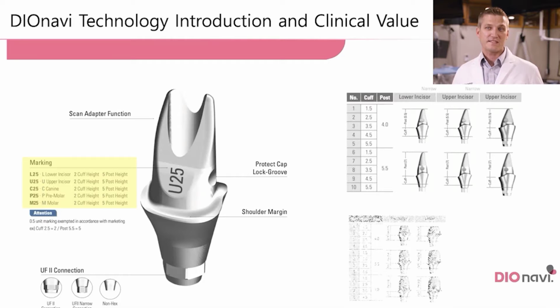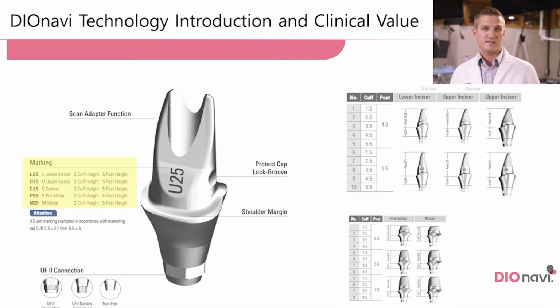They come in a variety of sizes, as I mentioned. You're seeing some of the size options right there. Based on anatomy, based on size and shape of the surrounding teeth and tissues, you'd select the right one from that. It's all done in the digital world, though, for you. So in the digital world, they can measure, look at that, hand select the right one for you.